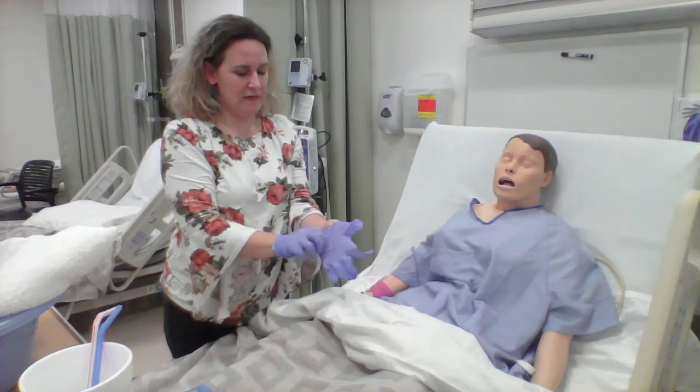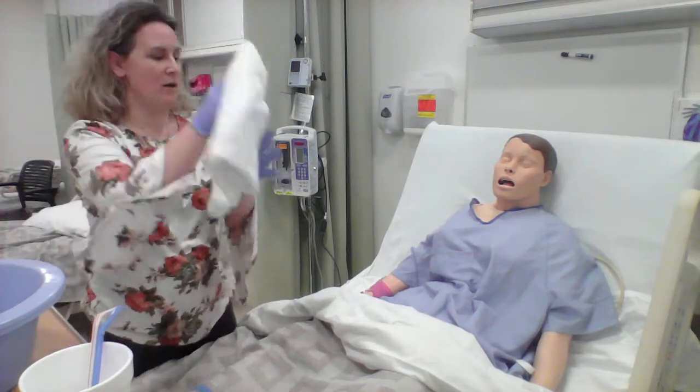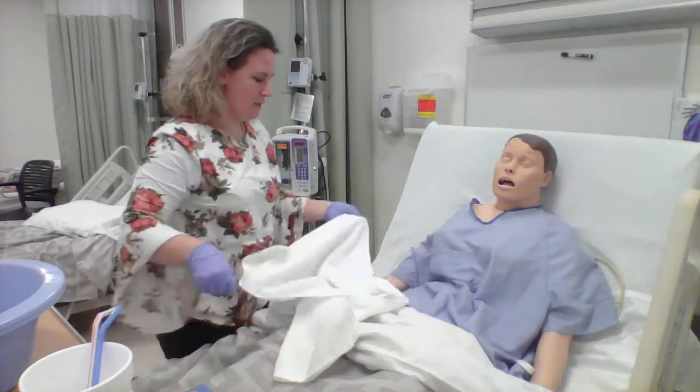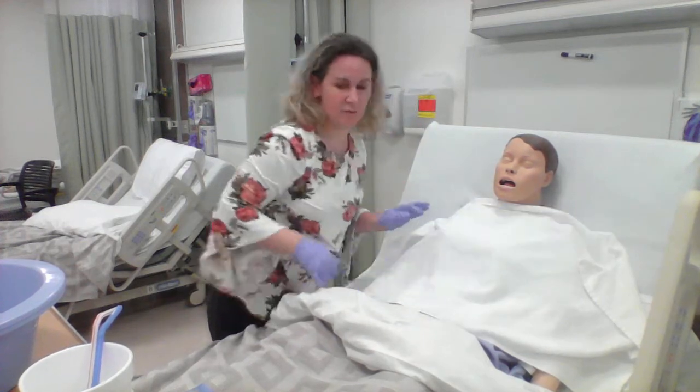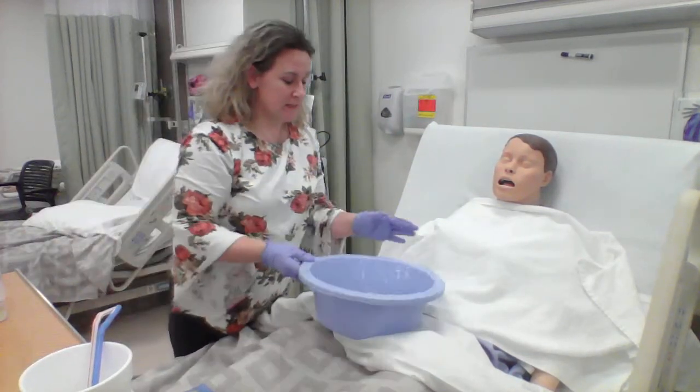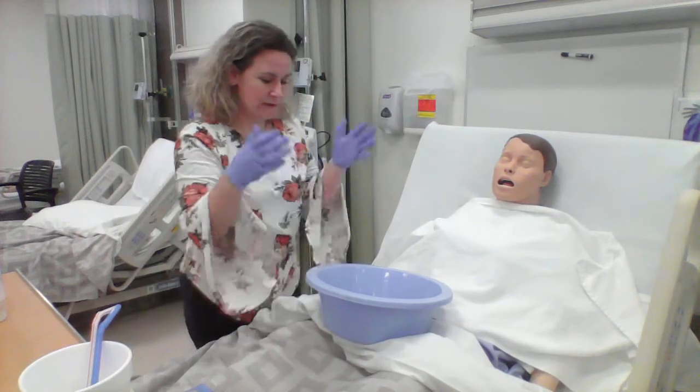The first thing that we need to do is place a towel across the chest. Sometimes when we put these things in, it can get a little messy, so we're just going to do this here to keep you clean. And I'm going to place this here on your lap. Are you okay if I do that? Patient states that they are.